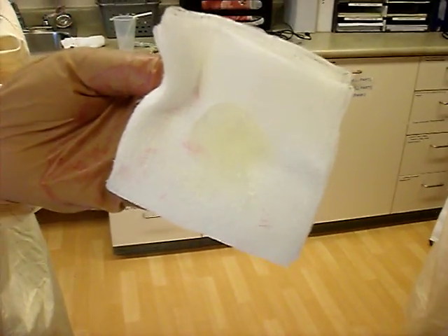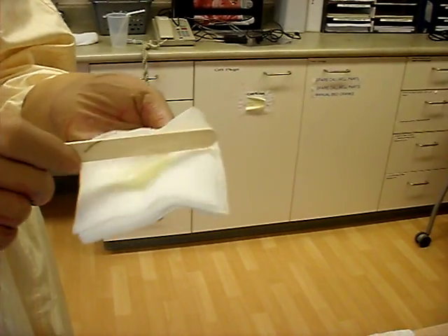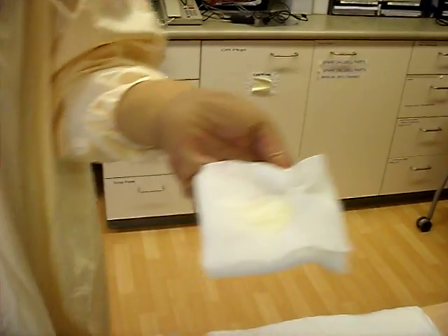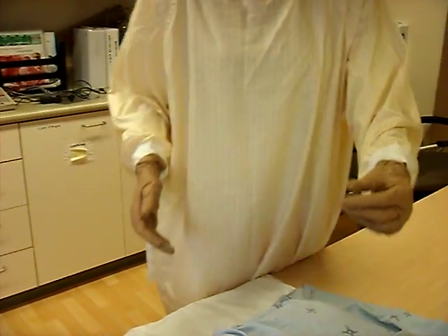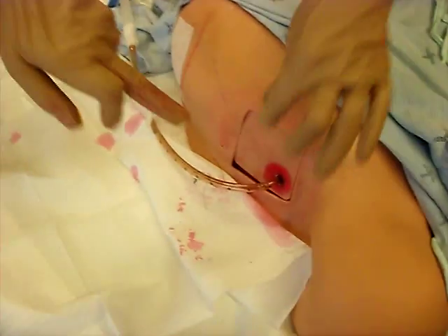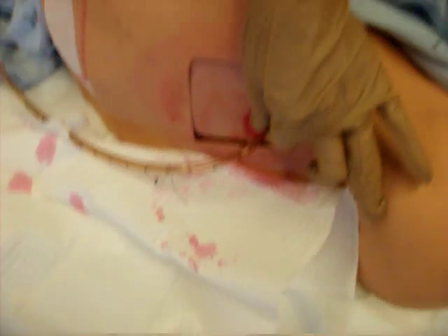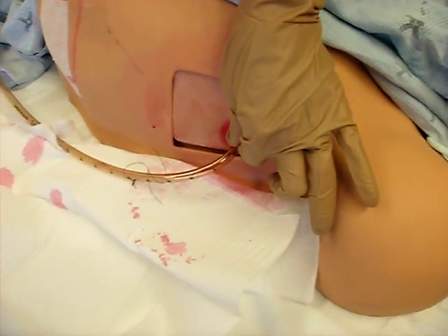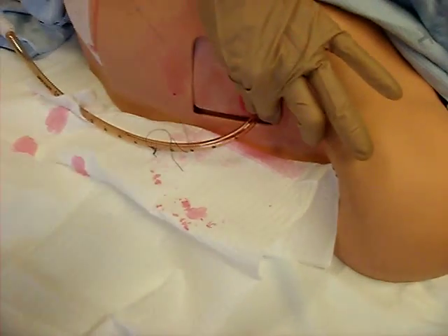For some of you beginners, I often tell you to put maybe 2, because if your timing is bad, you end up dragging the tube and half of the Vaseline through. So it's up to you how much you want to use. 1 or 2 should be sufficient. At this point in time, my assistant, who is going to be the pincher in this case, which will probably be the first opportunity you have to remove the chest tube, will, with sterile gloves, pinch the opening around the chest tube, making sure that when it's pulled out, she can physically close that while the gauze goes down over.